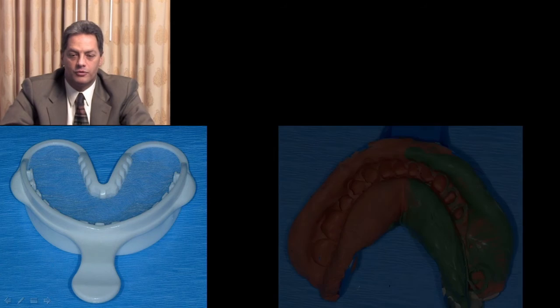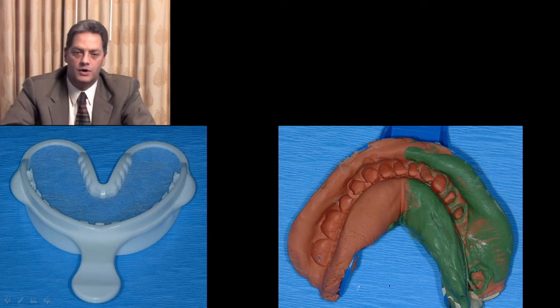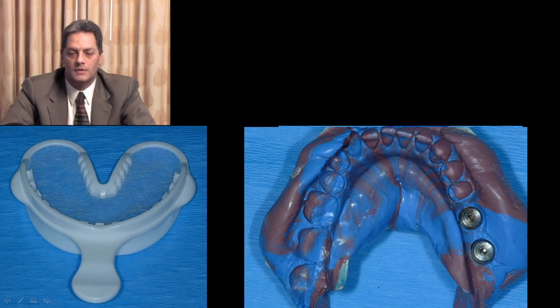I do not recommend taking impressions with triple trays, even though some people do. Here we have an impression done commercially, it's not mine, and this is on natural dentition, and you can see that the margins are actually not there. But if a flowable material with a lower viscosity was going to be utilized, this should have actually been utilized throughout the entire arch to have better occlusion, so the final restoration will not be high when it comes back from the laboratory. When we're talking about implants, in this particular situation we have a vinyl polysiloxane, and we can copy this in a much better fashion by flowing the material throughout the occlusal surface on the entire arch.